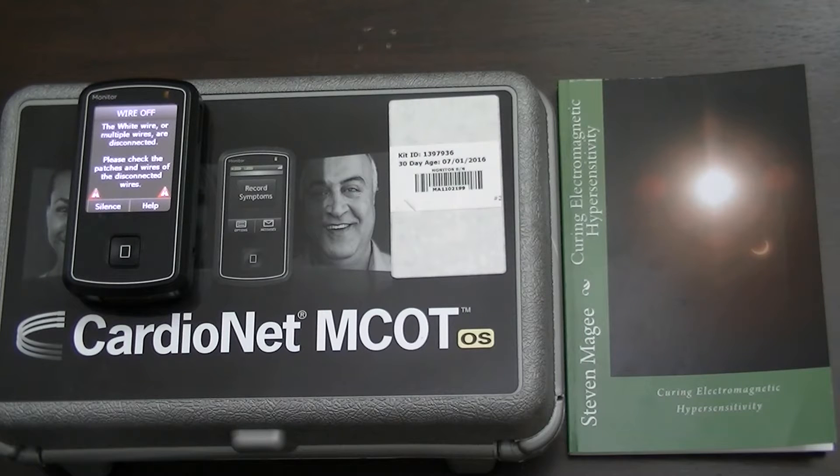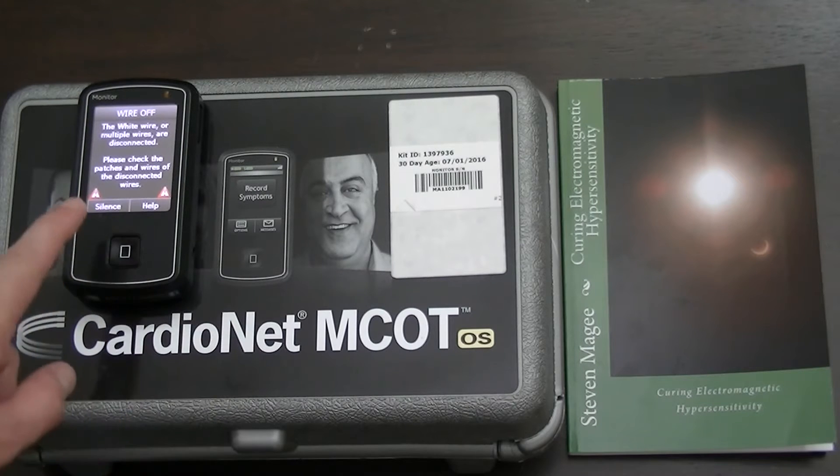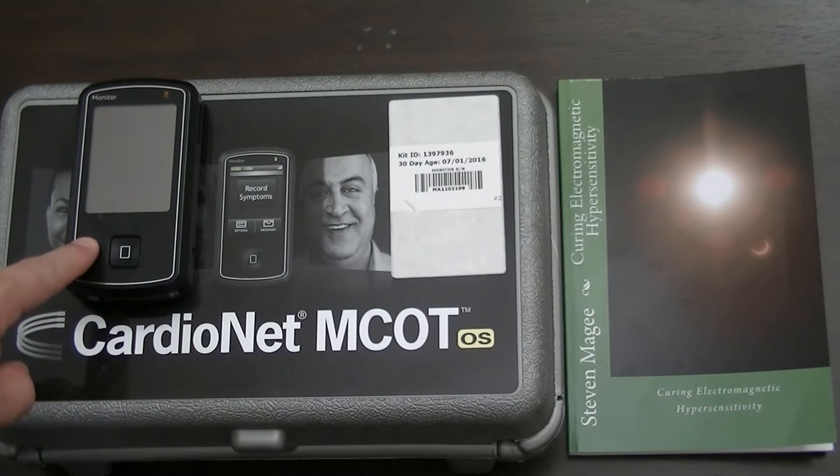Hi, my name is Stephen Magee and I'm the author of Curing Electromagnetic Hypersensitivity. We're going to take a look into the electromagnetic field emissions from the CardioNet MCOT belt mounted monitor.